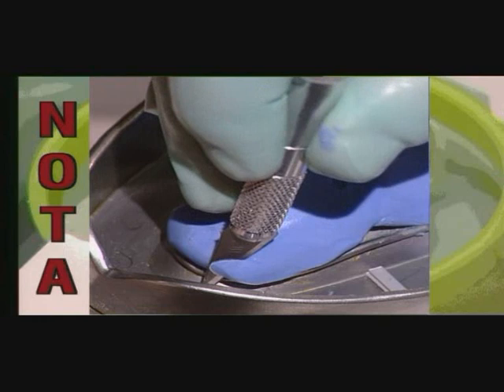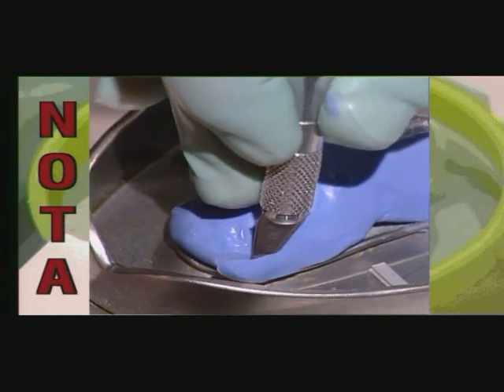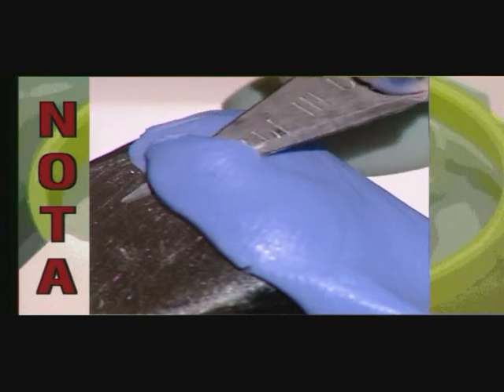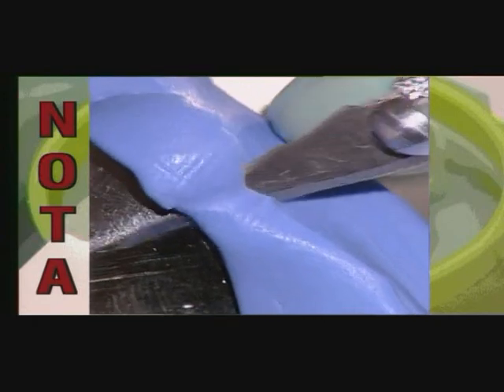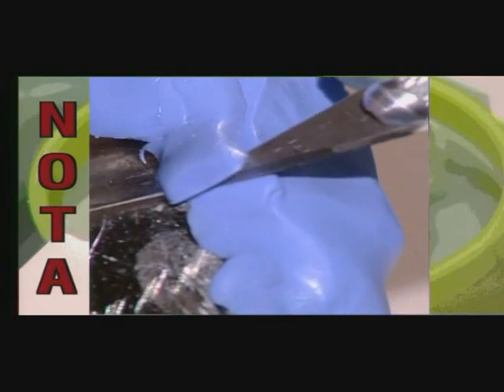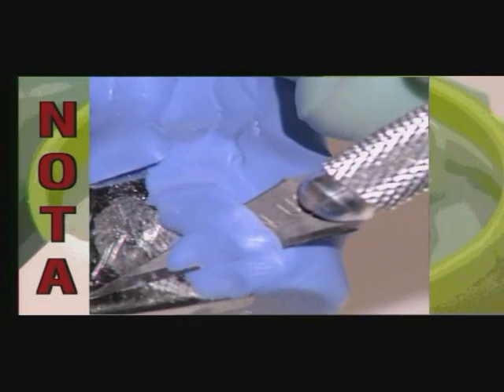Projecting edges restricting the actual impression space or obstructing the patient in impression taking can be removed with a scalpel or sharp knife. This is best done when the material has been cured as fully as possible.